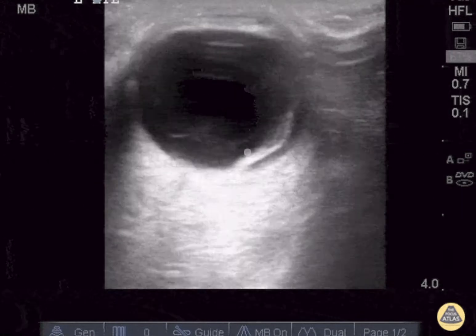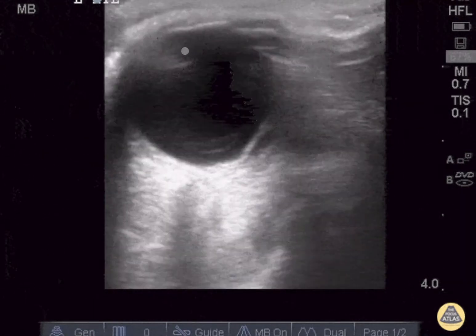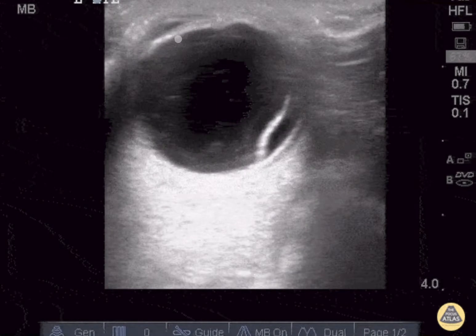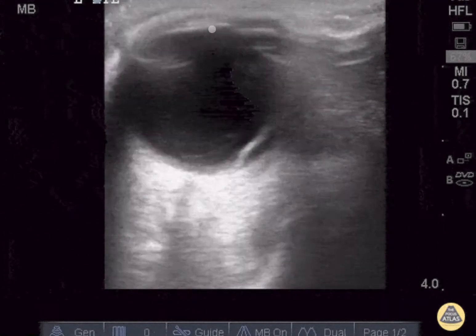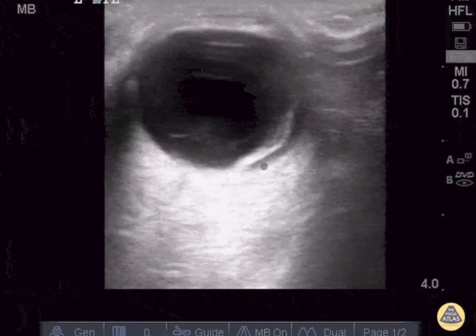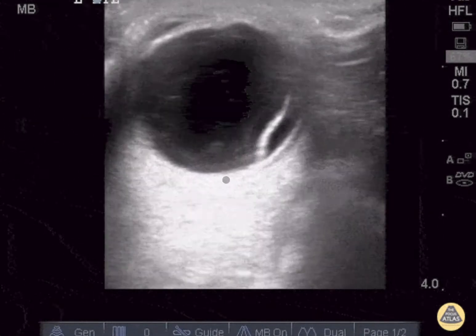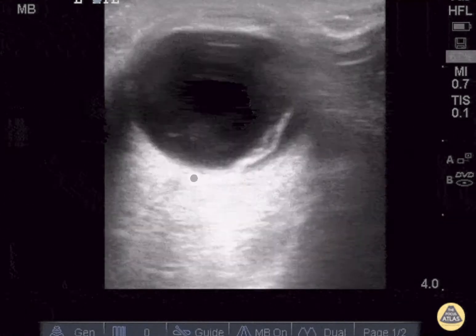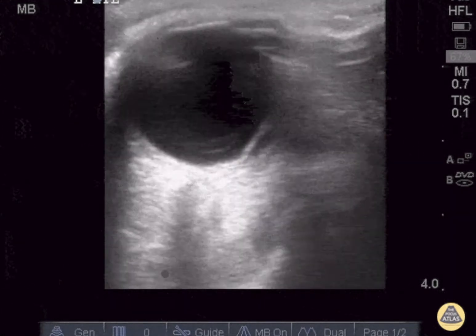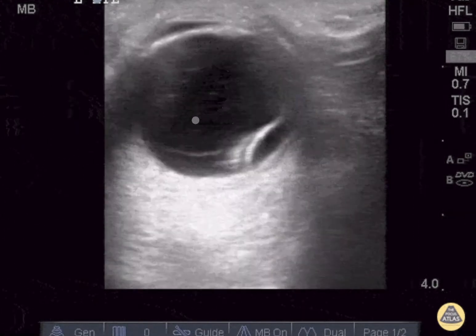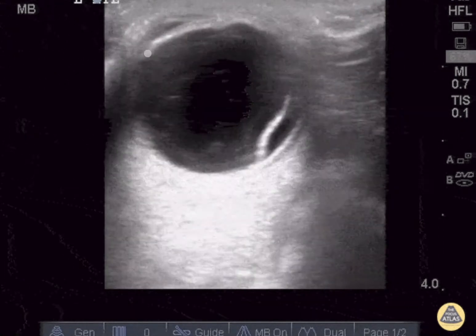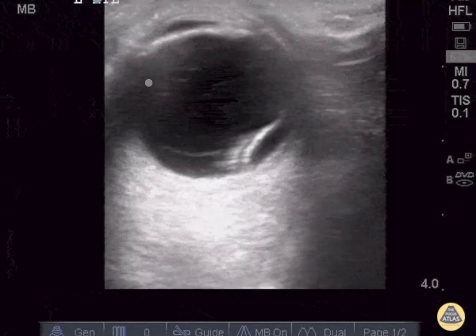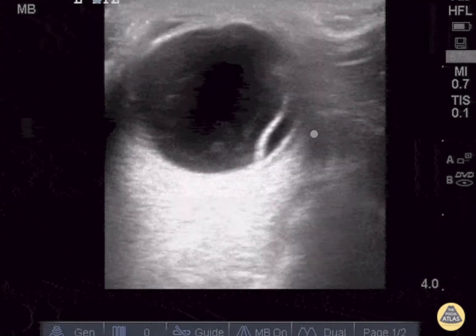In this image we can appreciate the orbit, cornea, and iris as this hyperechoic structure, and the back of the eye can be seen here. Notice as the probe is fanned back and forth we see a hypoechoic area coming down from the eye, which is the optic nerve. We also see some hyperechoic lines which are artifact.